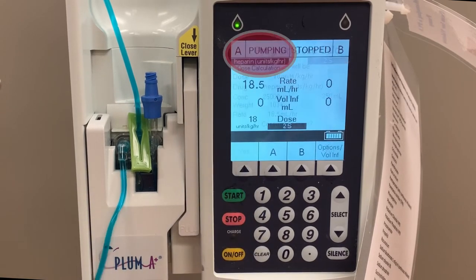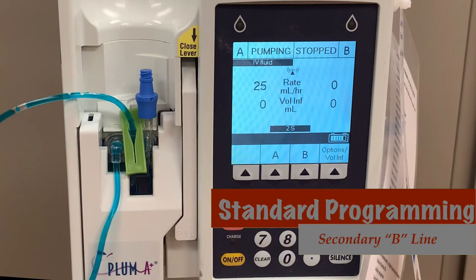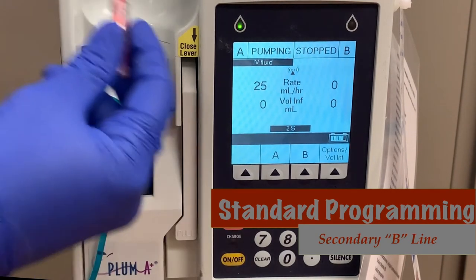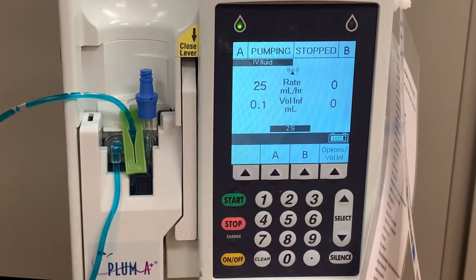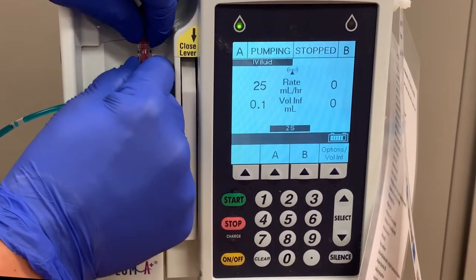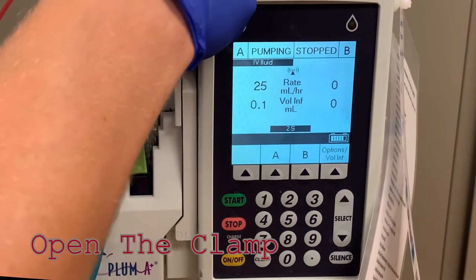You should now see pumping next to the A line in the top left corner. One of the features of the Hospira pump is that it is able to infuse two medications through the same pump. To do this, you'll program using the secondary or B line, sometimes known as the piggyback line. Begin by priming your medication into secondary tubing. Attach that tubing to the port on the top of the cassette.